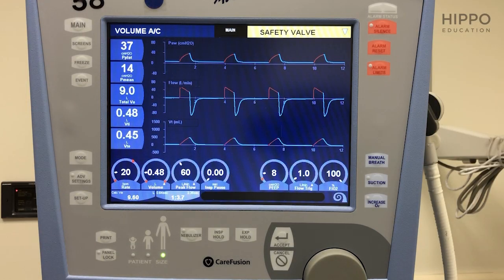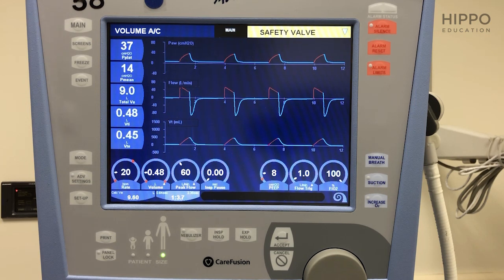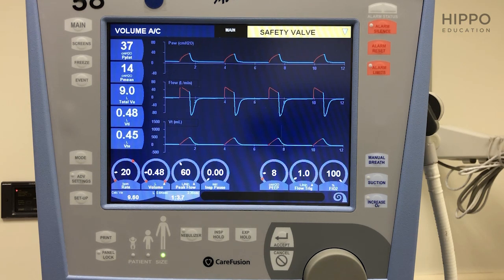Let's run through how to set up your vent right after you've intubated this patient. You've remembered this is your ventilator. You've plugged it into a power source in the back, plugged it into an oxygen source, usually on the wall or a tank, turned the machine on, and now this screen shows up.